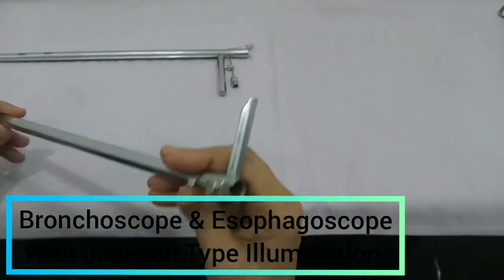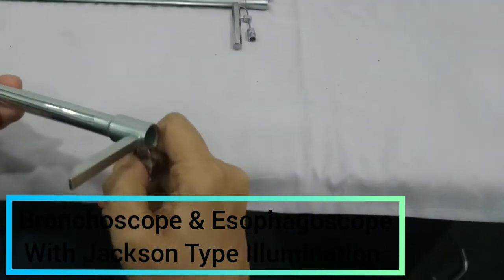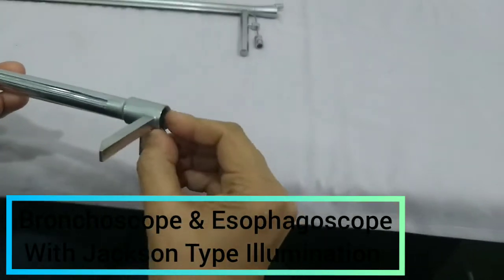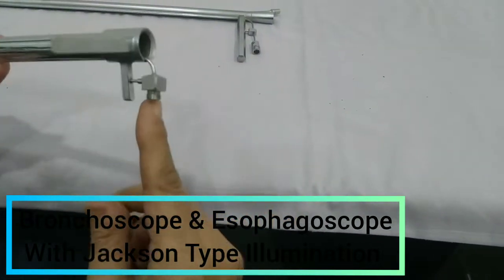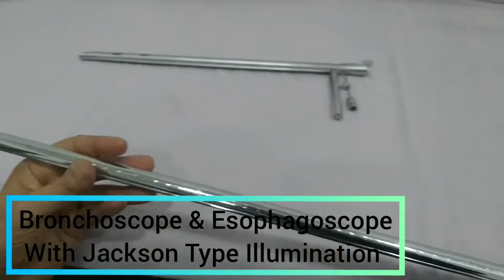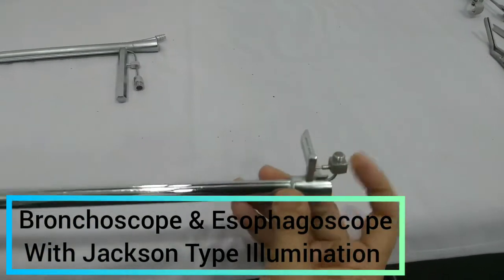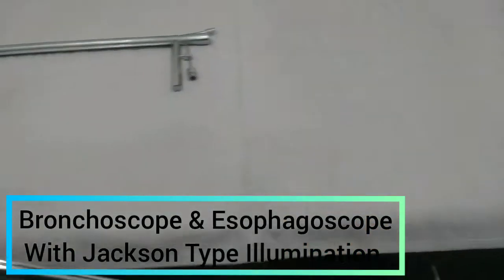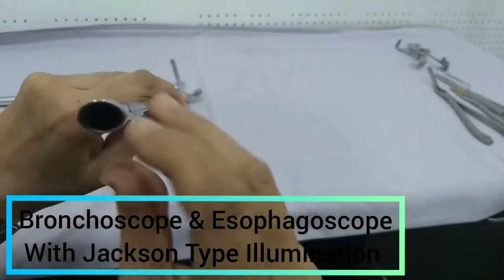Again you can see these instruments are having fiber optic carriers, and this is the light carrier. This light carrier will be connected through a flexible cable, and that flexible cable is attached to the light source. There are two types of illumination: Negus and Jackson. This is the Jackson type — you can see at the end of this carrier.